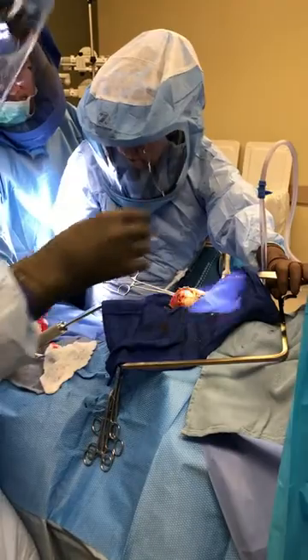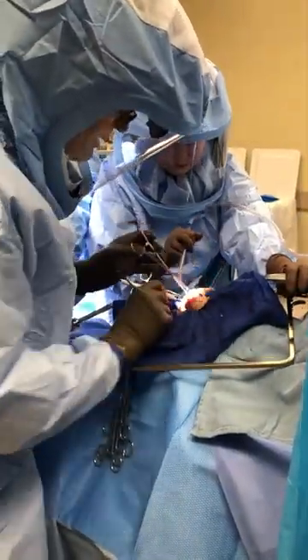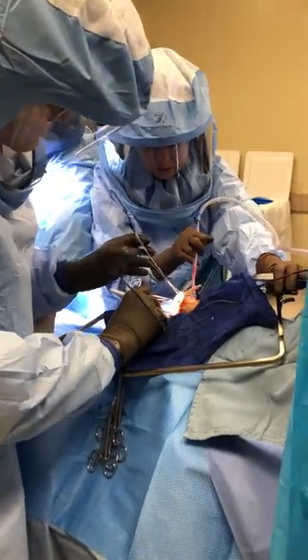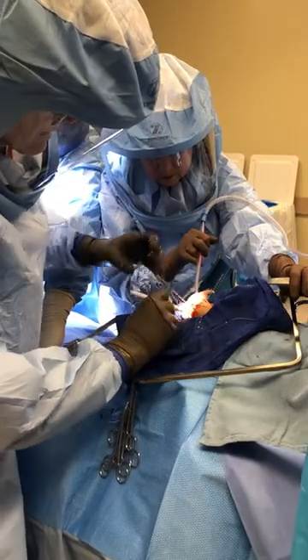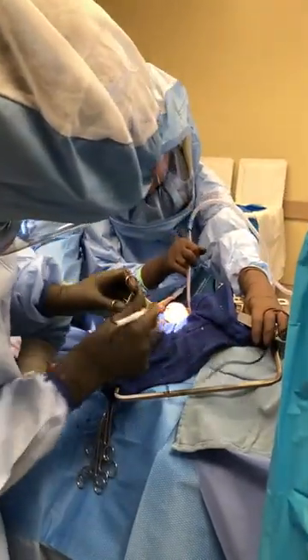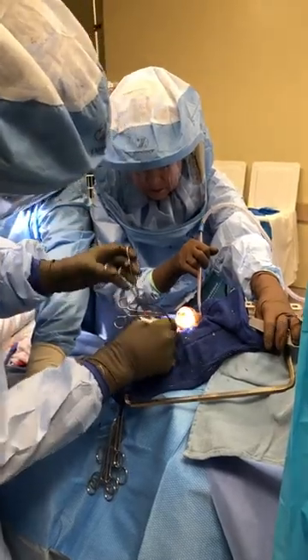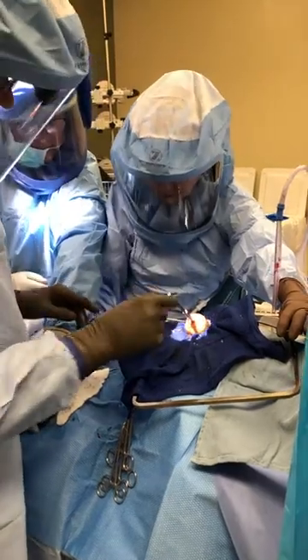Break away the bone. Hot poker, please. I like to just take this off gently so we don't strip any soft tissue off the neck. I want to make sure there's nothing down here.